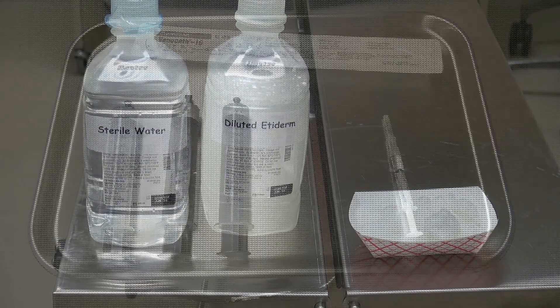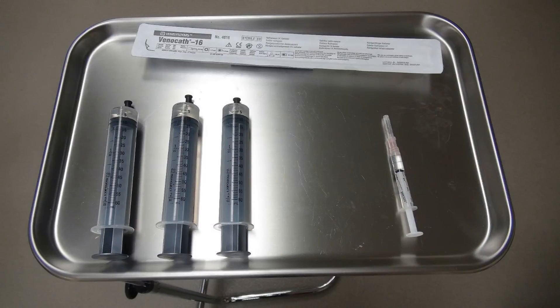Additional supplies needed include large syringes, either 35 or 60 ml, pre-loaded with about 5 ml of sterile saline solution. You'll also need a 3 ml syringe with a 25 gauge needle containing 2% lidocaine to block the skin. Aspirate about 1 to 1.5 ml of the lidocaine solution.